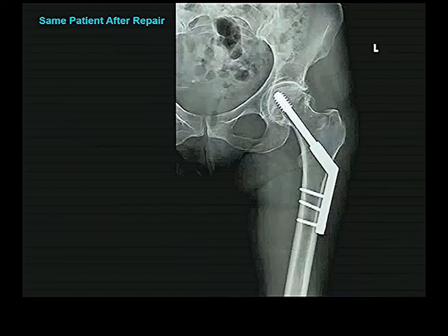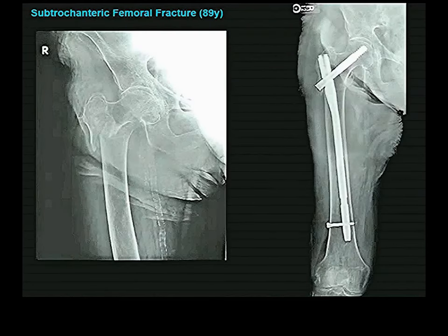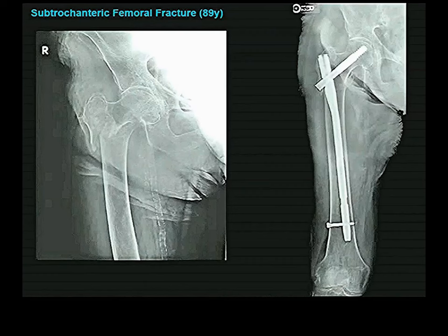Here is how that intertrochanteric fracture was fixed — with different kinds of bolts and plates, but again internal fixation. Here is a person with a subtrochanteric fracture, which requires large rods put down the shaft of the femur — still internal fixation.